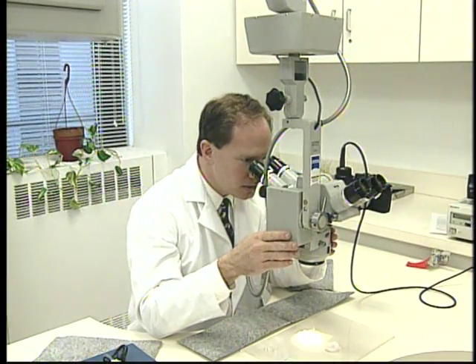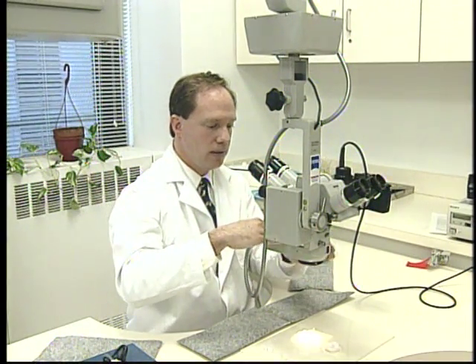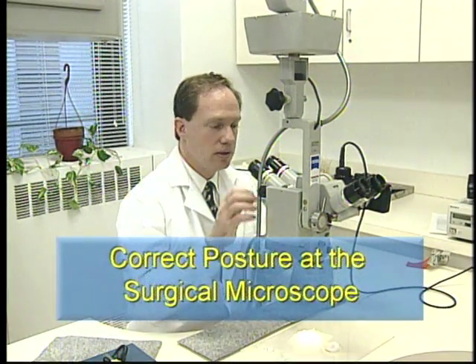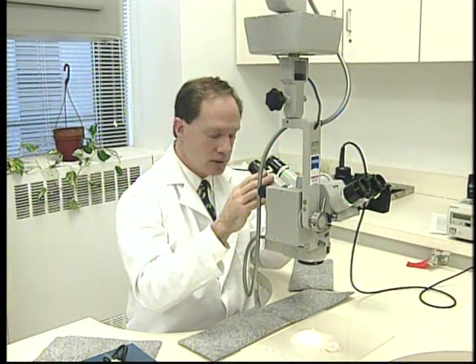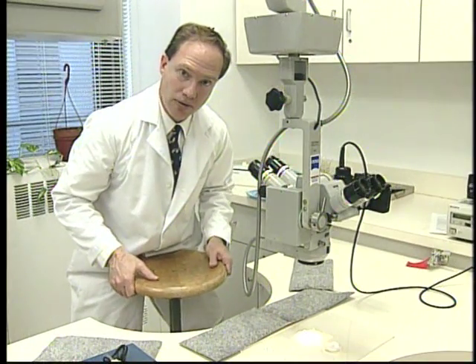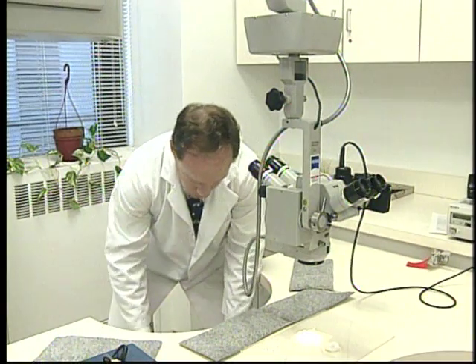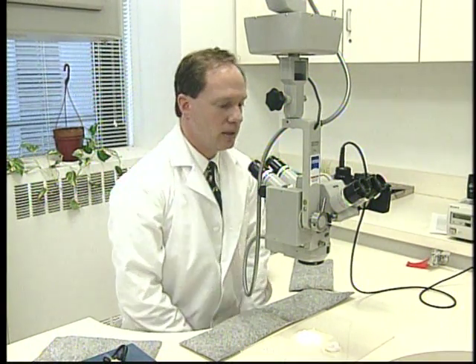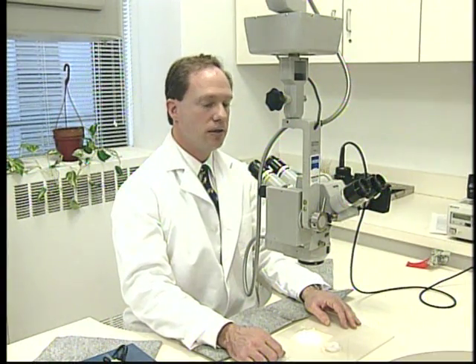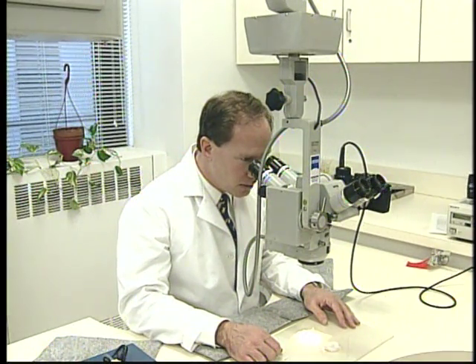Now, once this is set, you are at the proper position with respect to the level of the scope from your working field. You now have to position yourself in such a proper manner. In order to do this, it's imperative to have some kind of an adjustable chair that will move up and down so that you can position the height of your body at the correct level of the scope. You don't want to be too hunched over or too high up in the air. You'd like just to be at the correct level and to be comfortable looking through the scope.